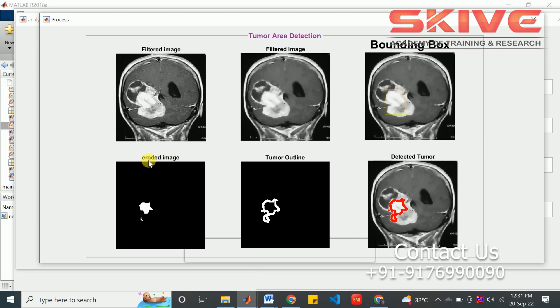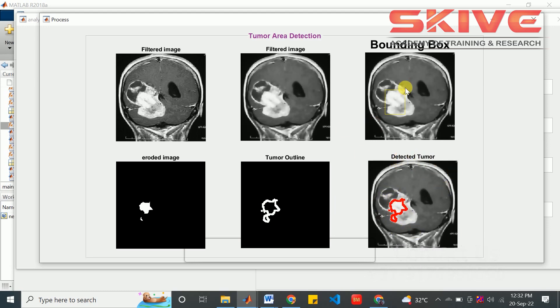This is the eroded and tumor outline image. Here, the detected tumor will be shown in this place. By this way, we can detect the tumor as well as the area of tumor present in the brain. Then we can treat the patients accordingly. Thank you.